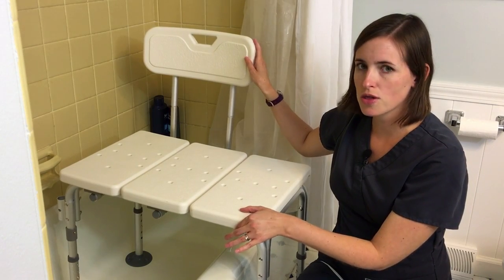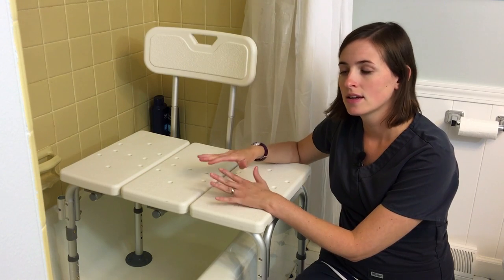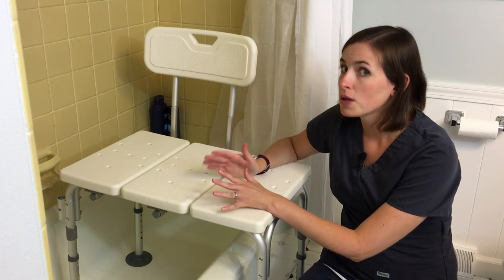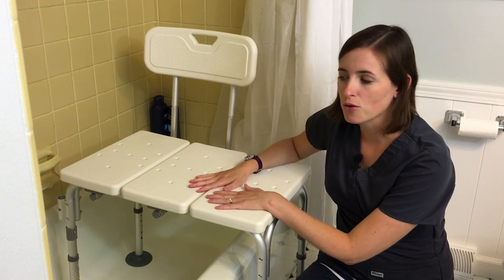They do have a little wiggle to them. That's normal because of the way they're assembled — there are a lot of joints and they're very lightweight, so they do move a little bit. Don't be alarmed; they are stable and they're going to hold you. Just be aware that they do have a little bit of wiggle to them.